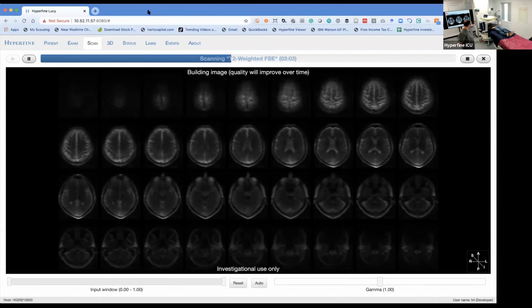Cool. So a couple of questions are coming from the audience. One question is about, are you able to do time of flight imaging and DWI imaging? Brian, you want to talk about that? Sure, I'll start with DWI.